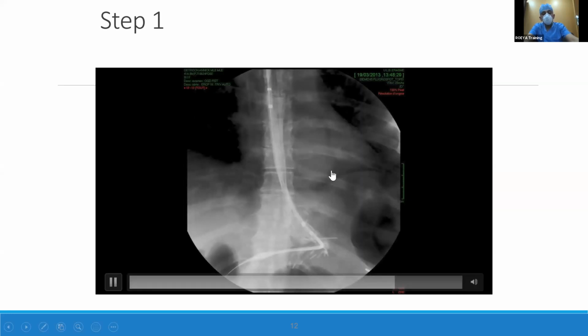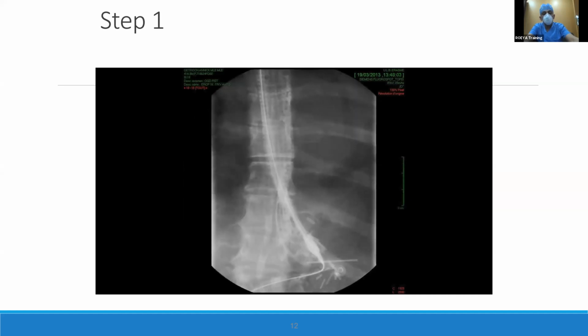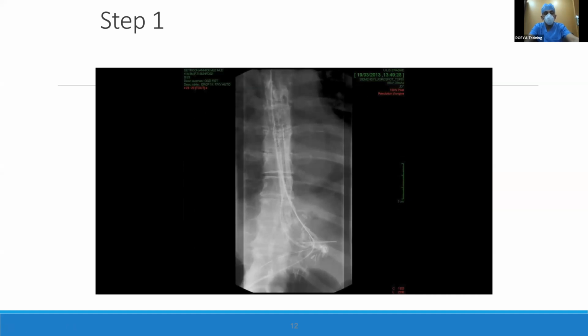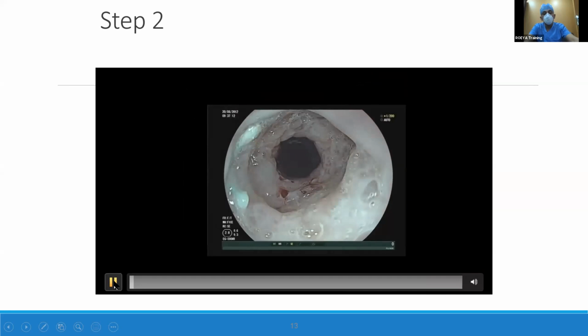And then the idea here is not only the stent; the water sealing happens because of the hyperplasia, which will happen at the distal part of the stent, and this is why the stent will stay in place. However, the difficult and tricky part is how to remove this stent. So this is why we have to do what we call the stent in stent technique.